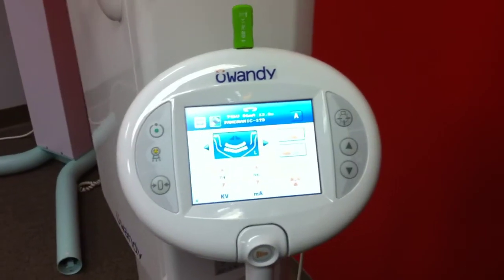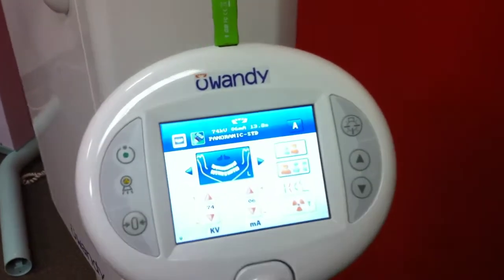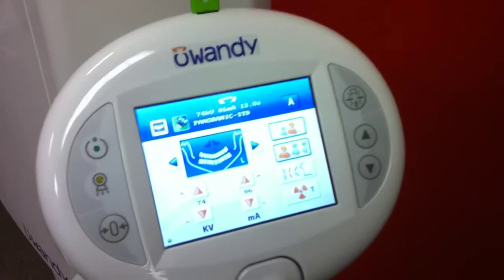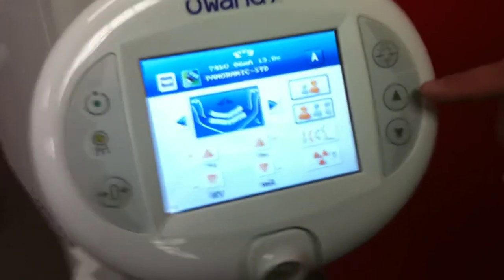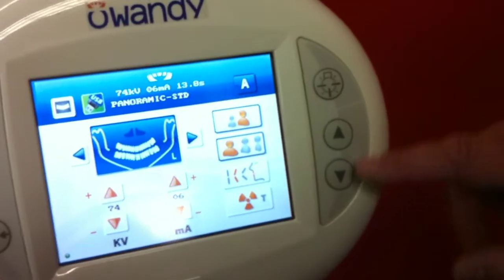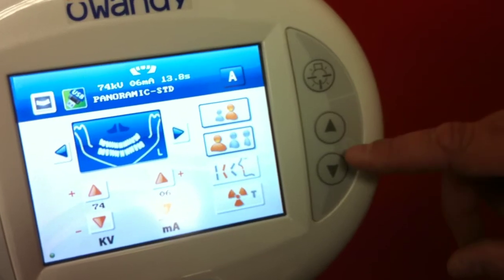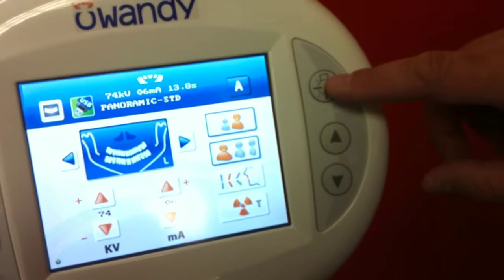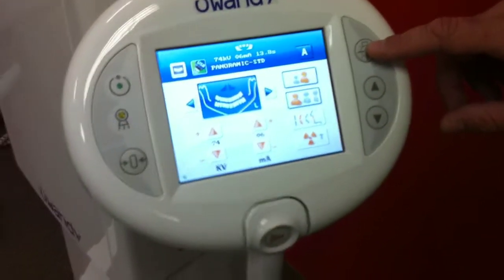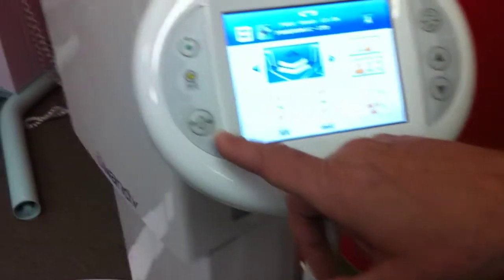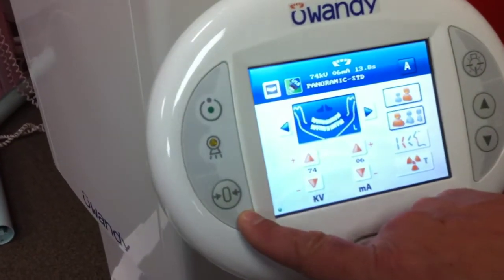This is the touchscreen control panel for the Awandi iMax Touch. It is a very easy panel to use. Here you have the up and down arrows for the adjustment of the height of the machine. This is the activation button for the laser alignment tool. And here is the set button to tell the machine you are ready for acquisition.